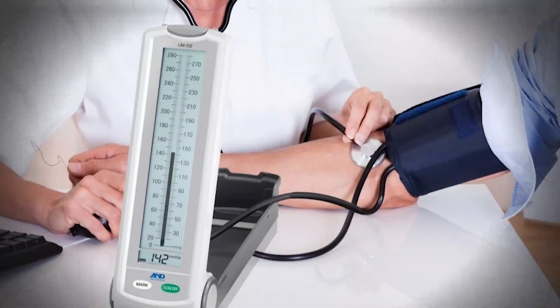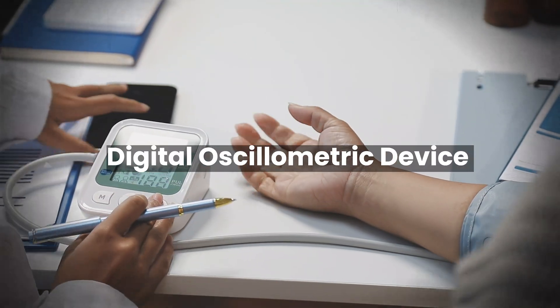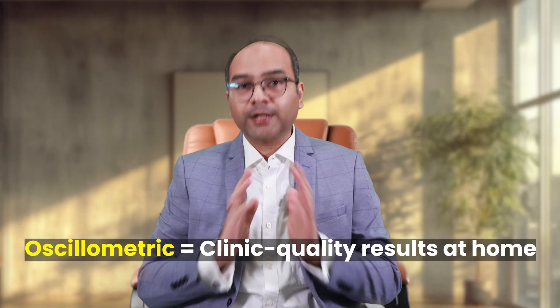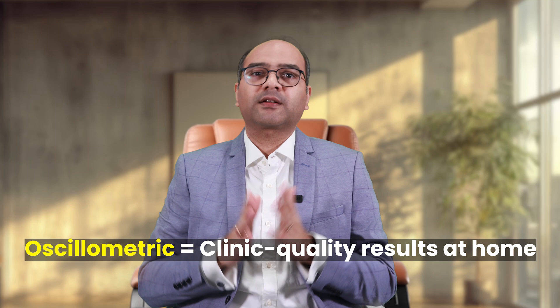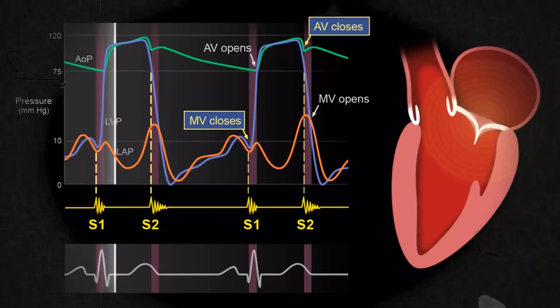Many patients ask whether they should use a mercury sphygmomanometer at home. Those manual devices are accurate, but only in trained hands — if you try to use them at home, you may end up treating wrong readings or ignoring real ones. Nowadays, even doctors use digital oscillometric devices in clinics, because they are clinically validated for accuracy, easy to use, and when used correctly, give a very reliable picture. They are not inferior to mercury or manual devices. In fact, oscillometric devices eliminate the human error that comes with using a stethoscope, especially in noisy environments or with elderly patients with faint heart sounds. Many trials studying hypertension and antihypertensive medications use automated oscillometric devices.